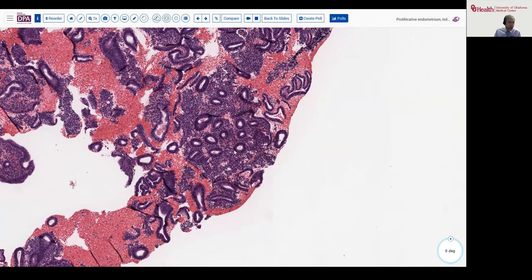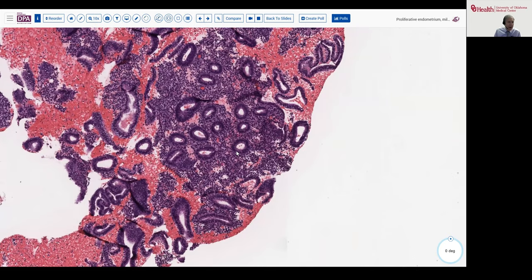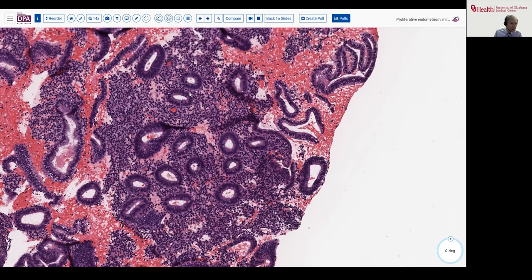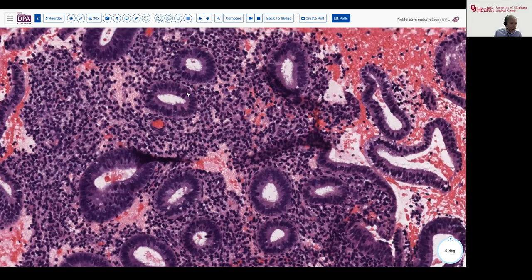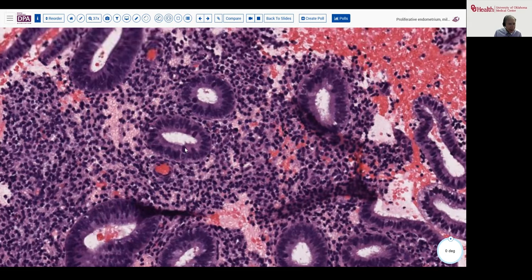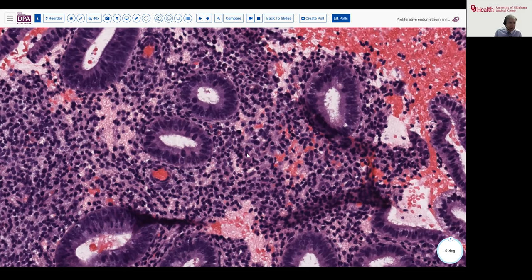You should also see mitotic figures, which can often be picked out at low magnification because the mitotically active nuclei move superficially towards the lumen. If you see a black dot towards the lumen of the gland that's not around the basal portion, that usually is a dividing gland. At higher magnification, you can identify chromatids sticking out in various stages, indicating mitotic activity. Occasionally, you'll find stromal mitoses as well.